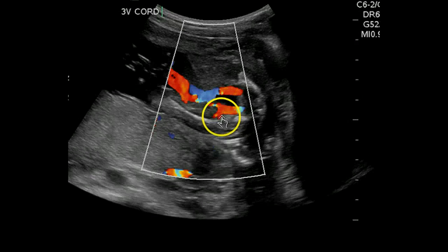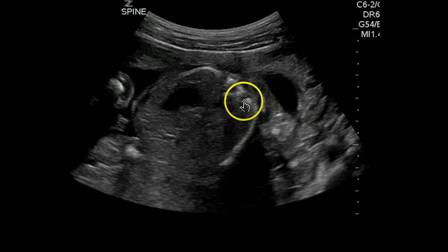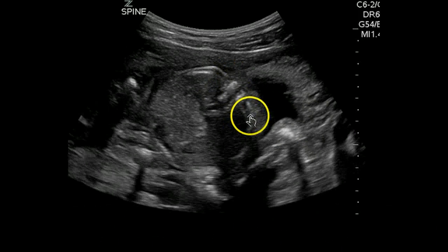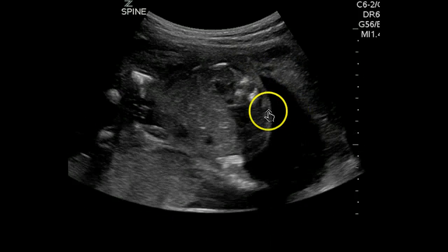Picture of the bladder. We should see the cord splitting around it, touching both walls of the bladder. That's normal. So it's a 3-vessel cord. Gonna head down through the spine. Everything's looking okay. There's no big masses extending out from the back of the spine.